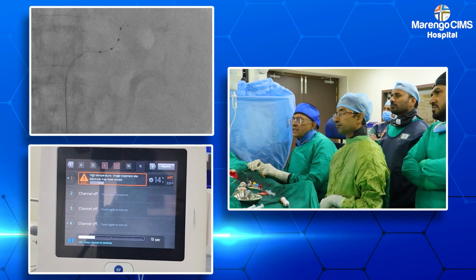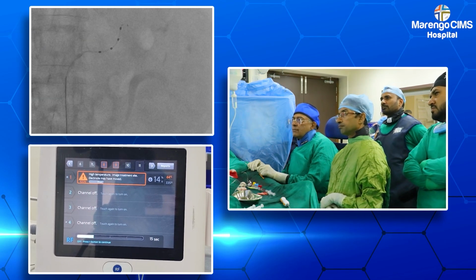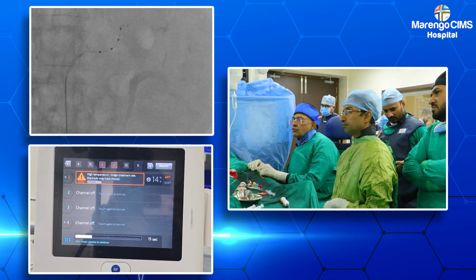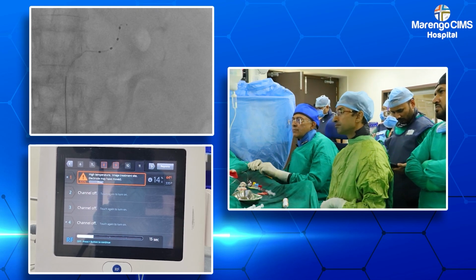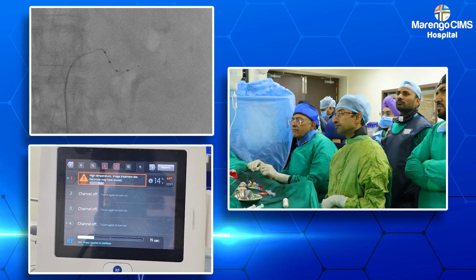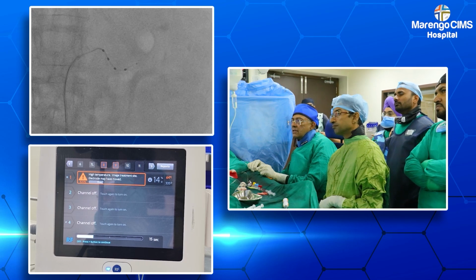So with this, we are very sure that we should not attempt any more in this area. It tends to get heated. And that may be because the artery size may be just right borderline. So we will now attempt one more in the inferior branch.